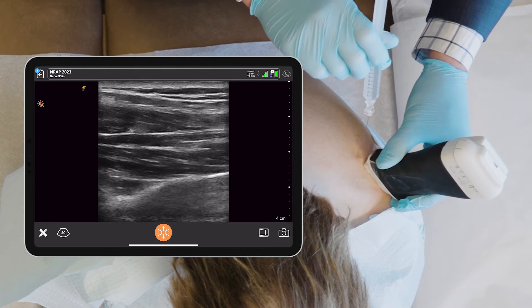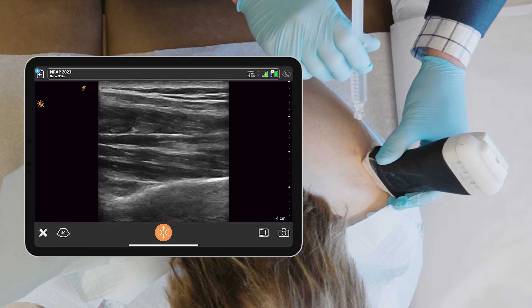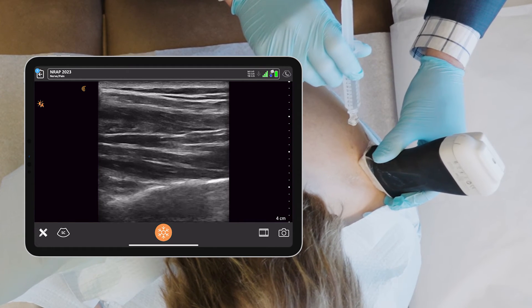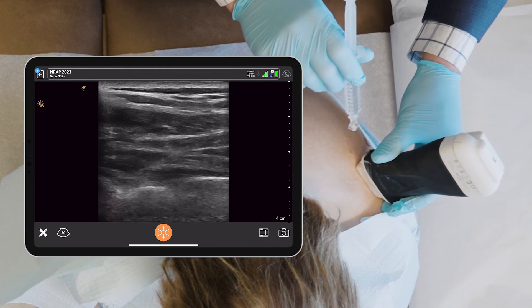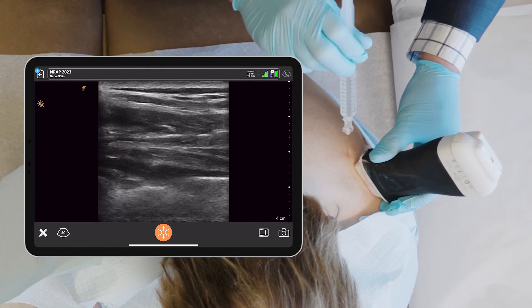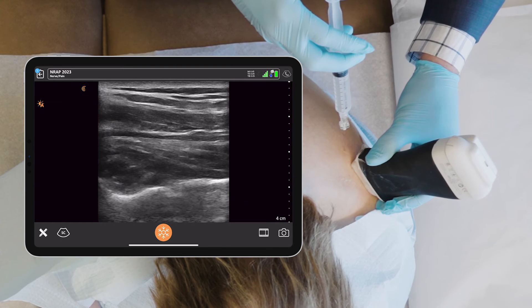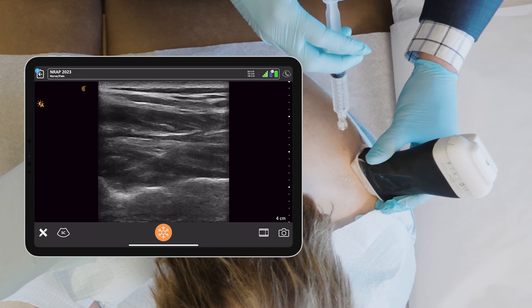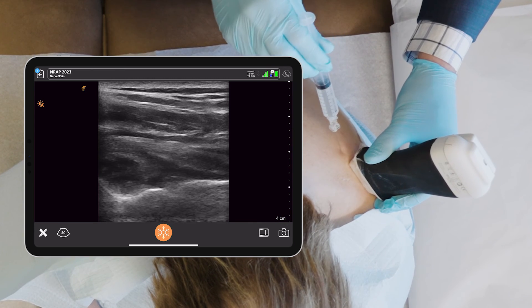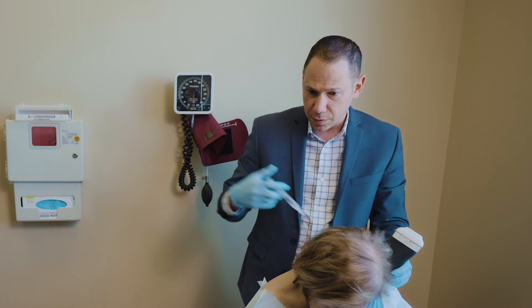Little pinch, Hoda. Half of my injectate captured. Moving in a little bit and increasing the angle to get to the other side. Okay, and that side is complete.